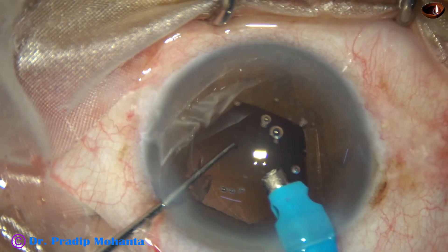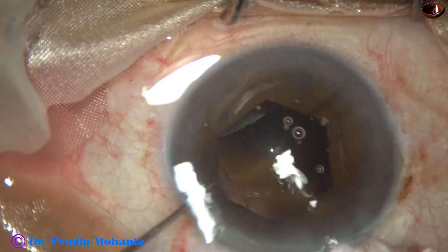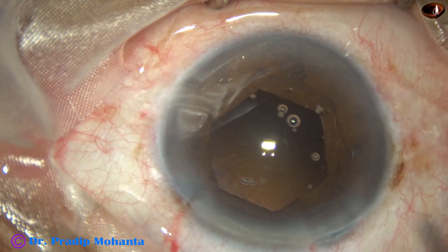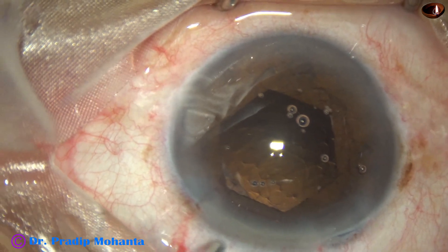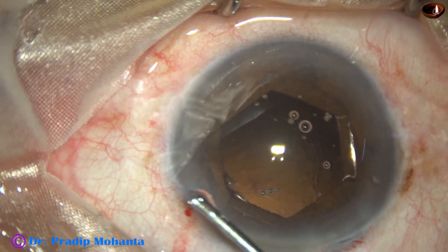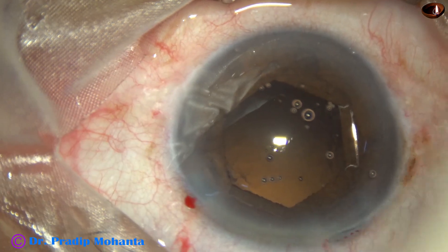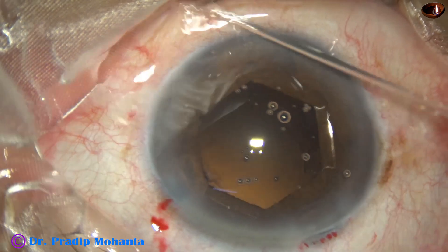The posterior capsule is intact. Though B-hex is in place, there is some iris tissue incarceration at the side port. So I bring out the phaco handpiece first — whenever there is iris tissue incarceration at the side port, remove the handpiece first, let the iris fall back, and then remove the chopper.